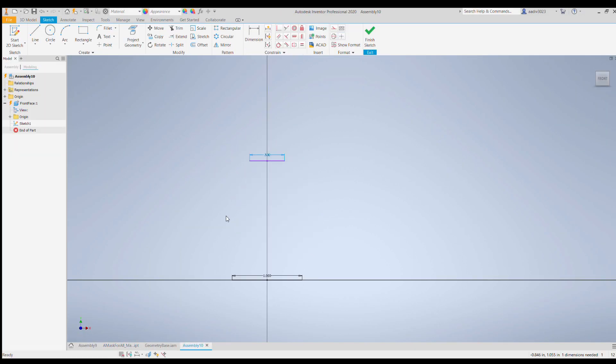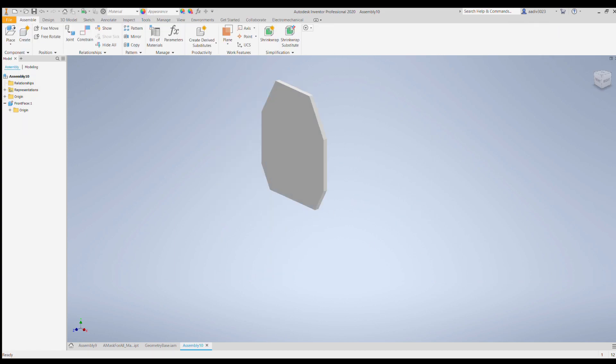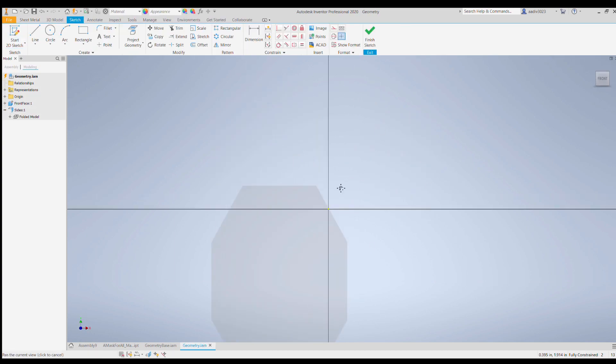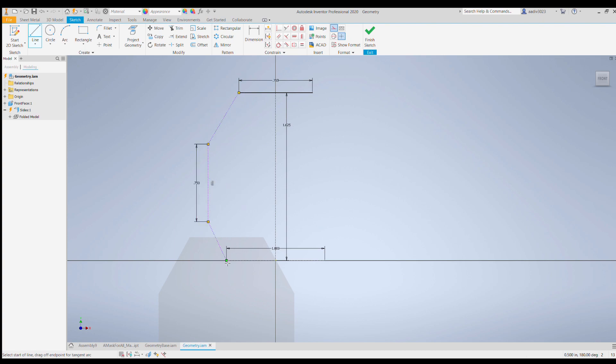Alright, update on the geometry. The last iteration was really blocky and geometric, so now I'm kind of redesigning the geometry to better resemble a mask for all's design.